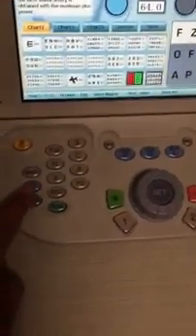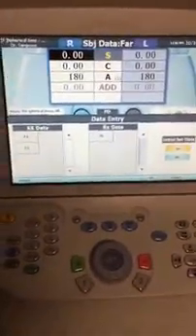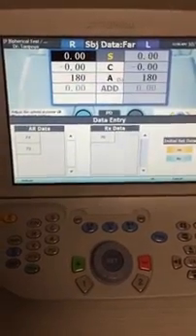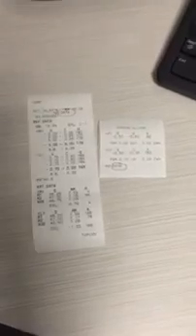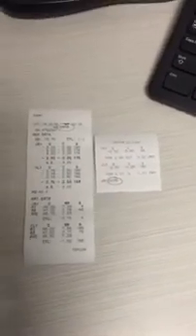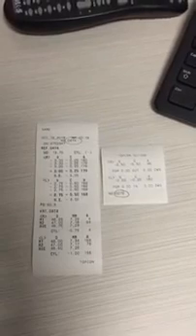Okay, so how do you input the new information? The next button that you need to be aware of is this blue button here. It's called the In button. You can see it right there. So when you press In, a list of AR data and prescription data or lensometry data will show up. And the staff member is going to paperclip the printouts that came from the pre-test machines to the intake forms. And I circled the number for each corresponding test.